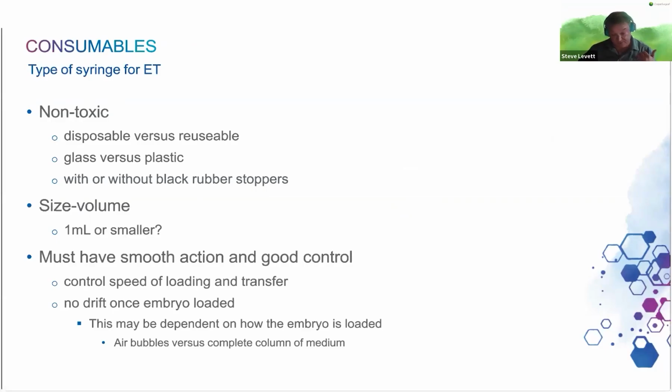The syringe is generally extremely cheap, but an integral and important part of the transfer procedure. So I would argue nowadays that we always need to use a disposable syringe.